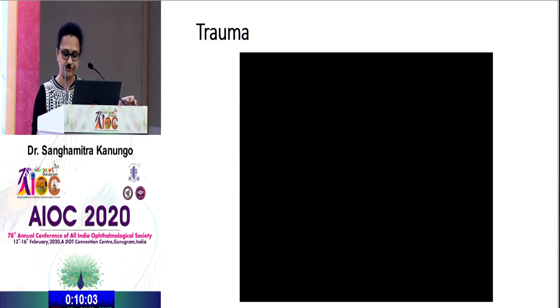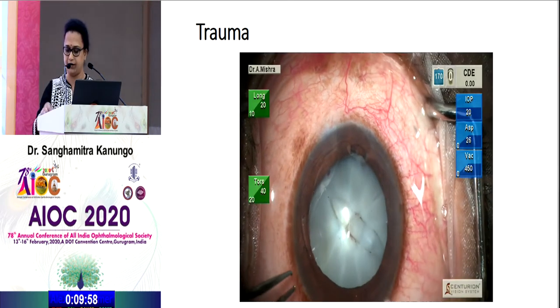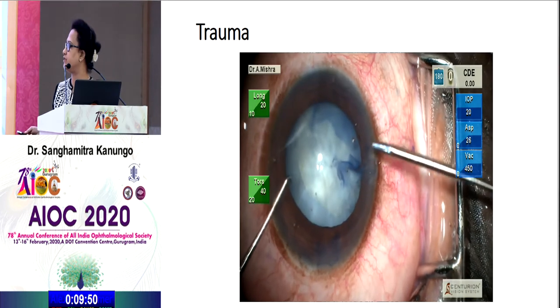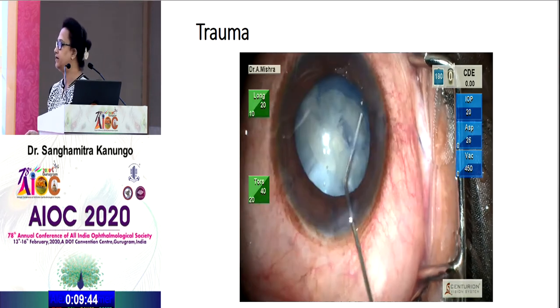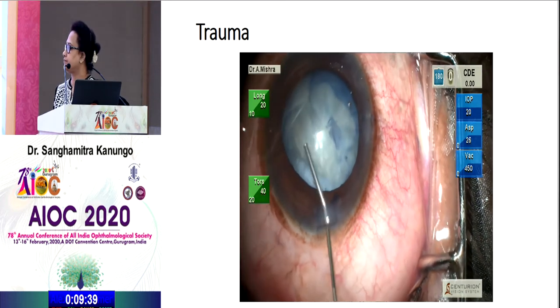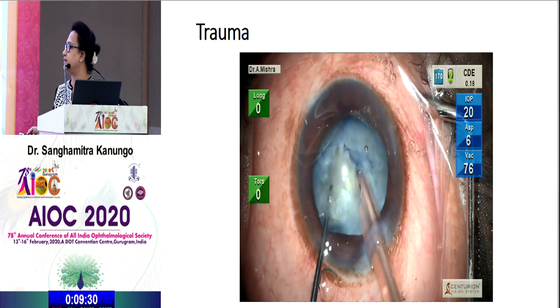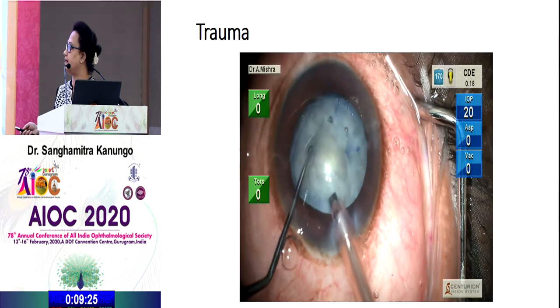The first case is a trauma case where there is a rupture of the anterior capsule. The surgeon tries to do a phaco, does a rhexis, but the rhexis margin gets extended. A minimal hydro-dissection is done. The cortical matter and nucleus are quite soft. The surgeon tries to do phaco and rotate the lens, but rotation is difficult, and the rhexis that had extended extends even further.